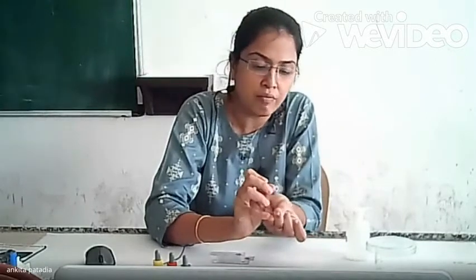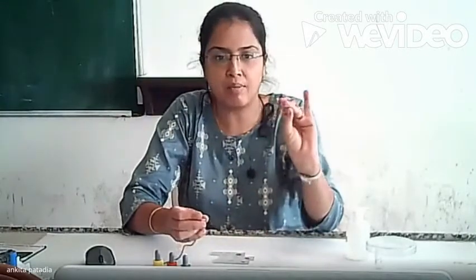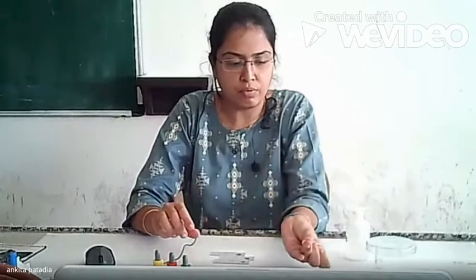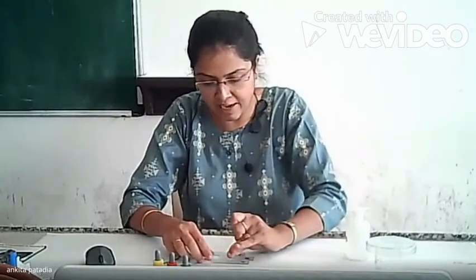Now prick the fingertip like this. So the first drop will come, and you have to wipe the first blood drop. Allow blood to form a drop and then collect in the cavity slide.